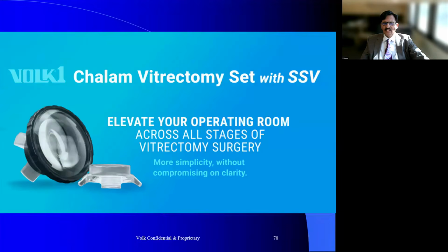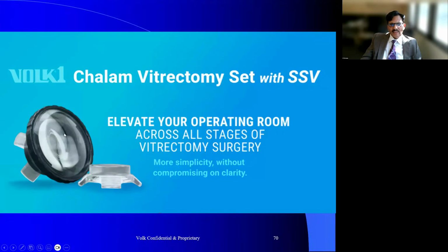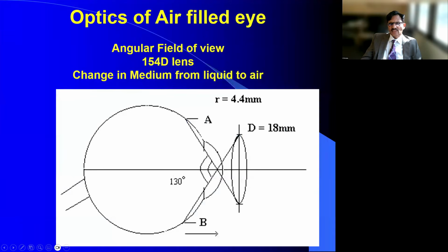Sterilization limitations: as I said earlier, steam sterilization can ruin your lenses, and simply soaking in a disinfectant is not allowed by some operating rooms. So one way to get around this would be lenses made of material that is steam sterilizable at any given time, or disposable sets which you can throw away at the end of each case.